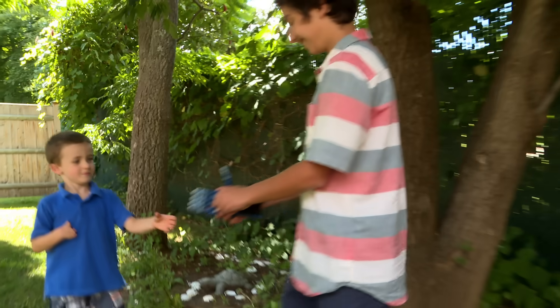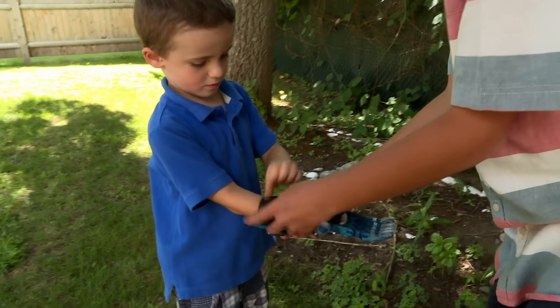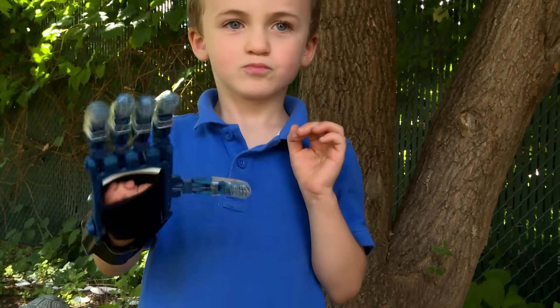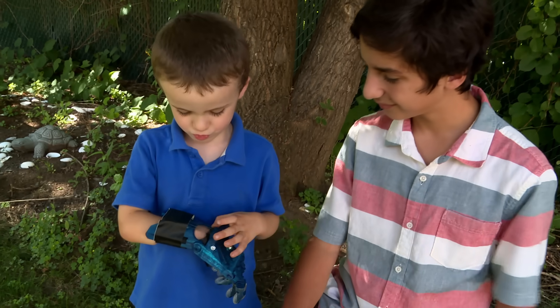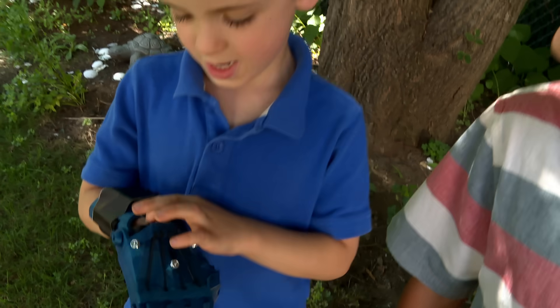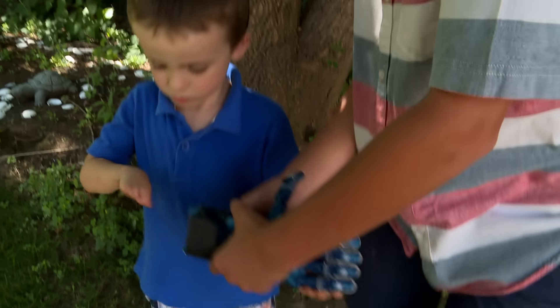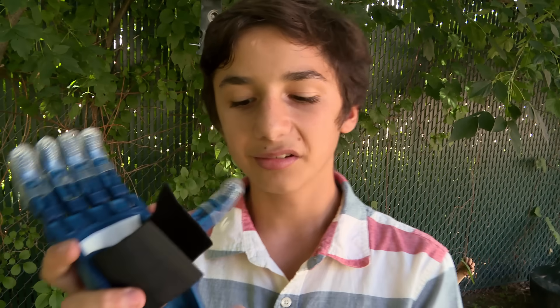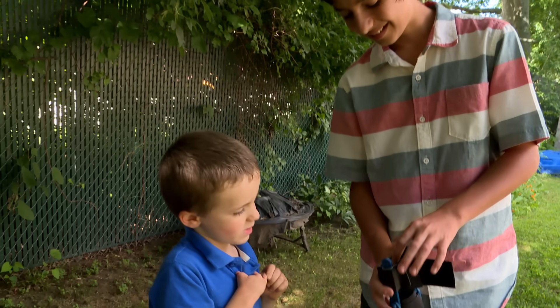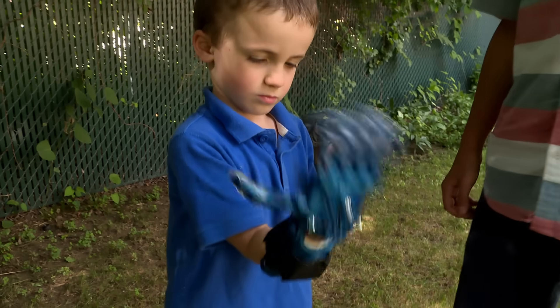I can't wait to try this with Max. Is that for me? Uh huh. What do you think? Is it easier to move? Is it comfortable? It's a little uncomfortable. Where is it uncomfortable? I may be able to fix that. Max told me that the Raptor is hurting his hand right here on the top of the gauntlet. So I'm going to put some foam under this velcro and see if that will help. Did you put foam in it? Uh huh, right there. So now it shouldn't hurt your hand like it did last time. It works!